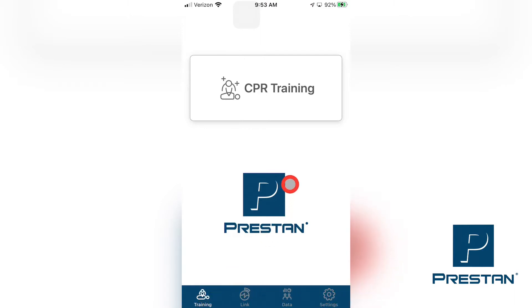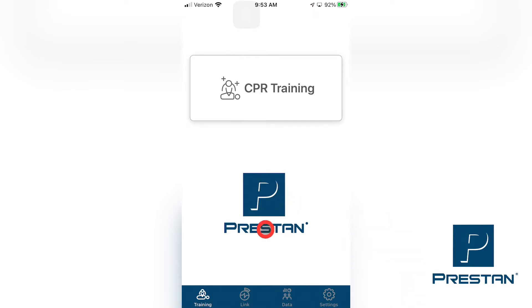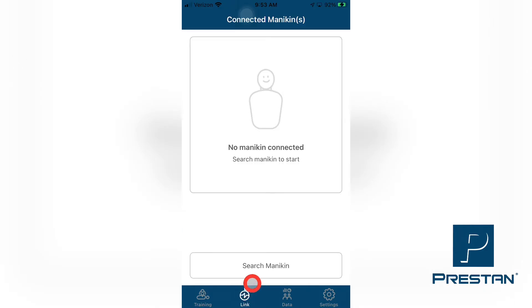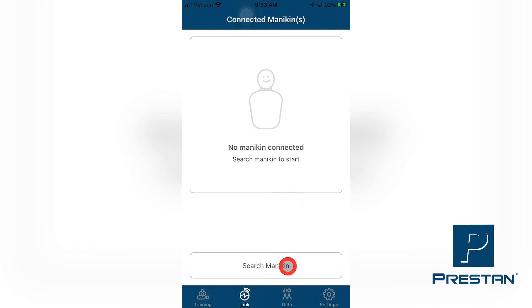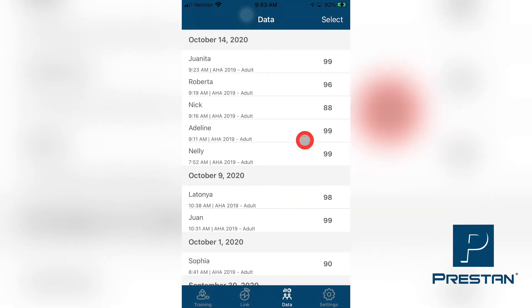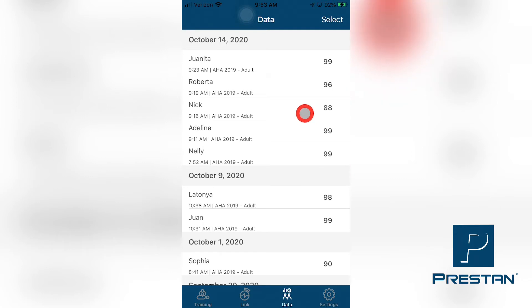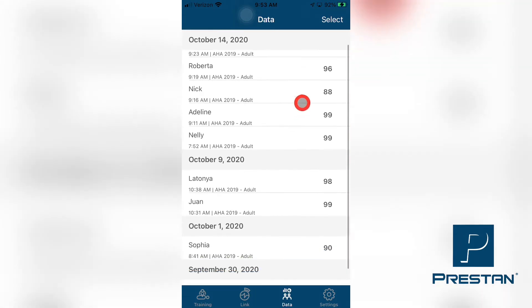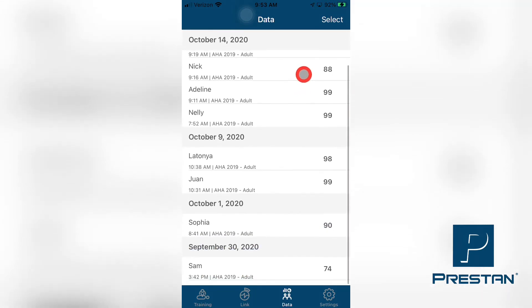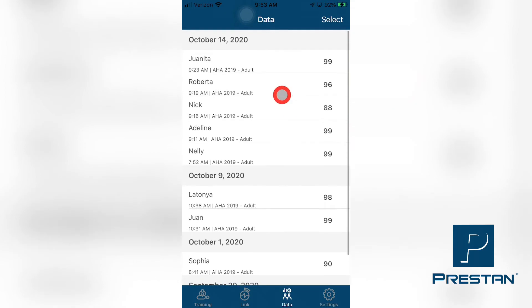The training tab allows the instructor to monitor the training of up to six mannequins per device in real time. The link tab will allow the instructor to connect to and manage all of your mannequins. The data tab allows for the access and review of any historical training data that has been completed and captured using your smart device.